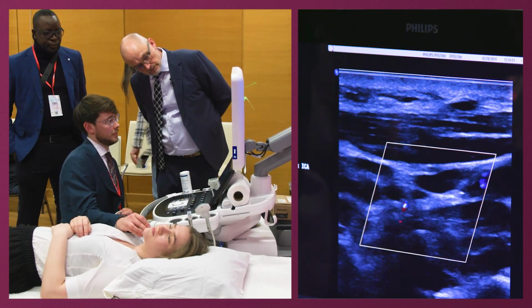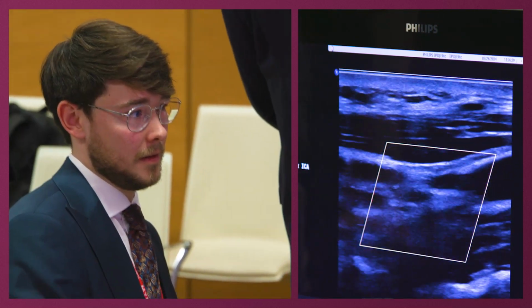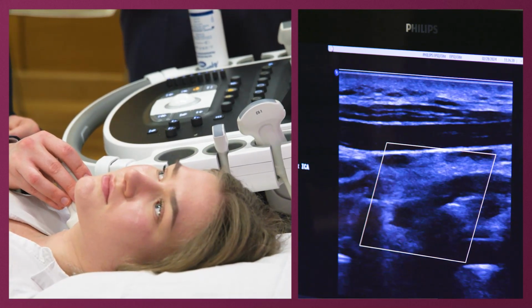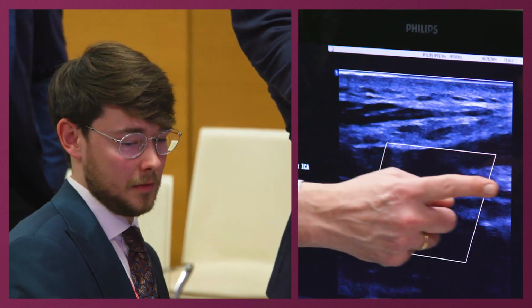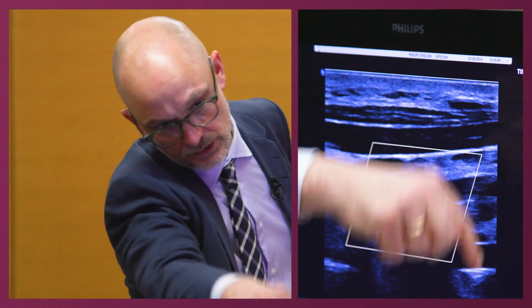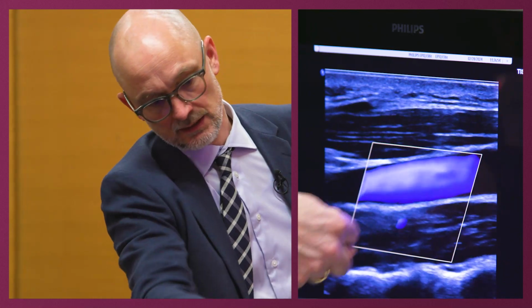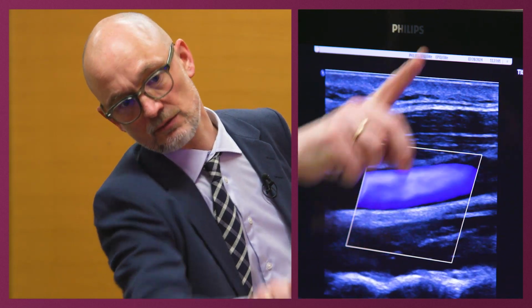You need to make one of them red. I think you're sliding off. You're allowed to look at the neck now. Get back on the track. Yes. Good. You know, you should not always believe the color, because you could have pushed some buttons so it was reversed. But when you look at this, what's running towards the skin is going to be blue, and what's running away from the transducer is going to be red. So I would suspect that a vessel feeding the brain is running more away from the transducer than towards it, and so I think this is a vein because it's running more towards.